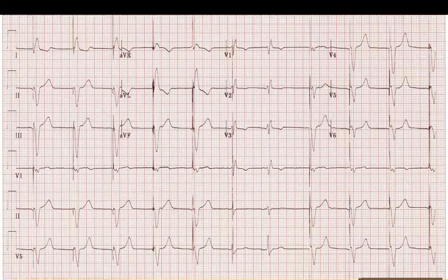Start with one lead, it's easier for you, just to follow a rhythm strip. Take lead II and follow it as a rhythm strip, and then you could use the other leads for extra information. It's always useful, if you just want to look at the rhythm, to follow one rhythm strip, and then you could divert into other things later on.